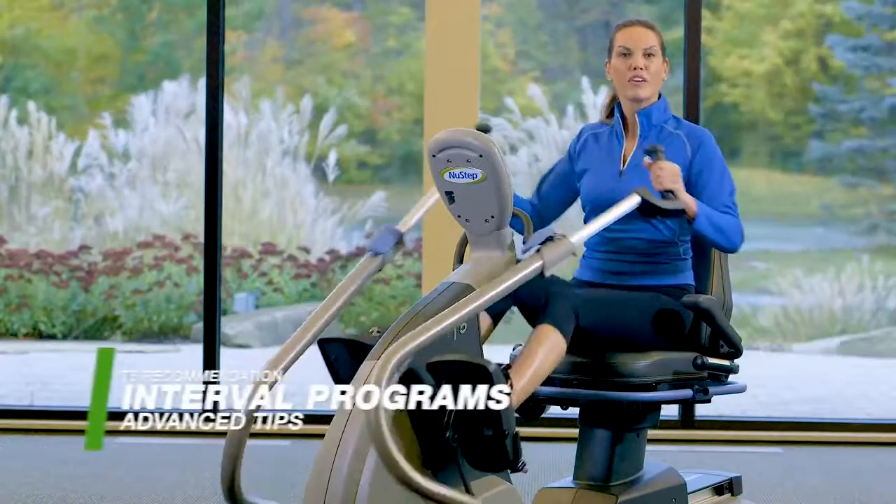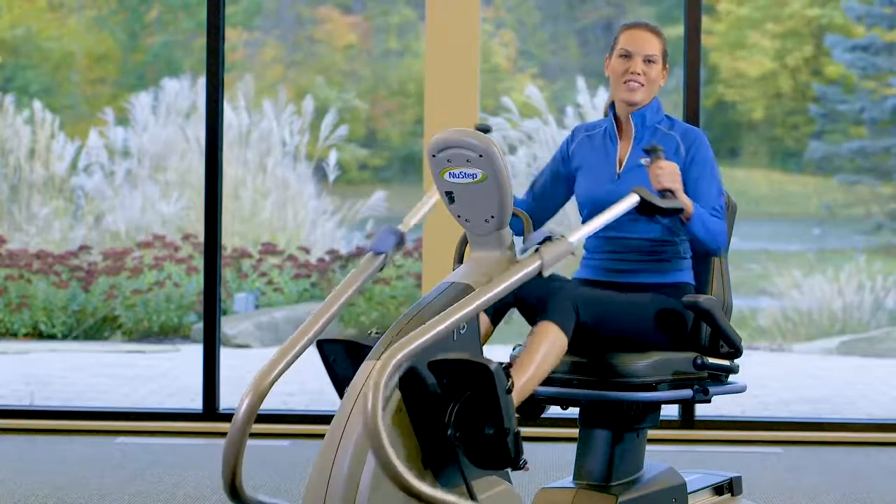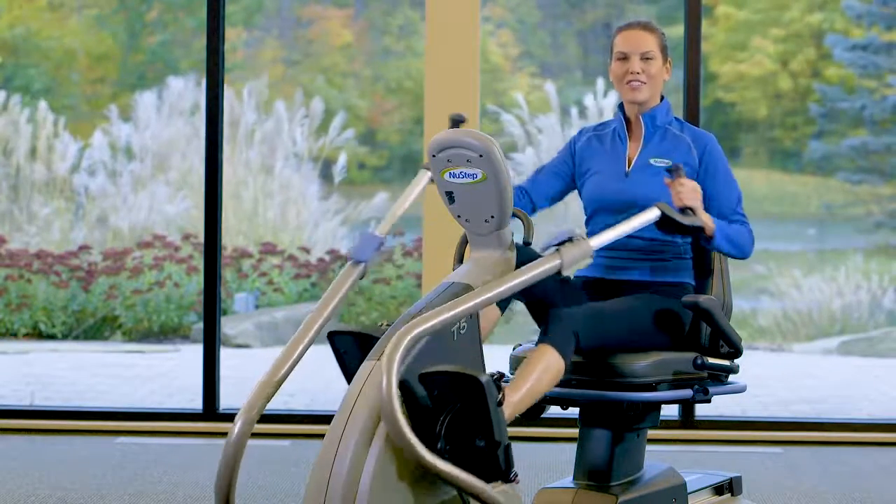There are also five interval programs available on the T5 models. The strategy is to keep your muscles guessing for a more effective workout.